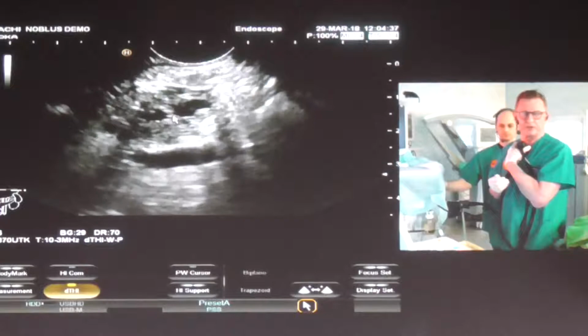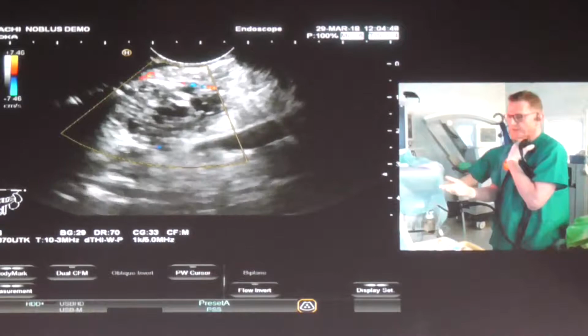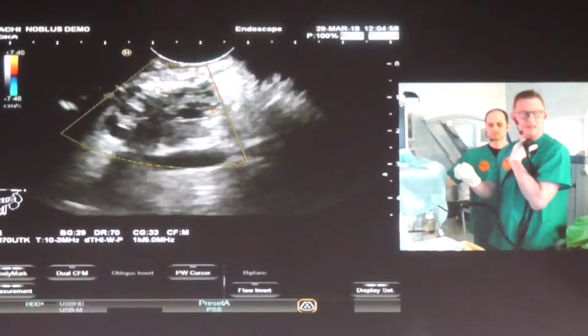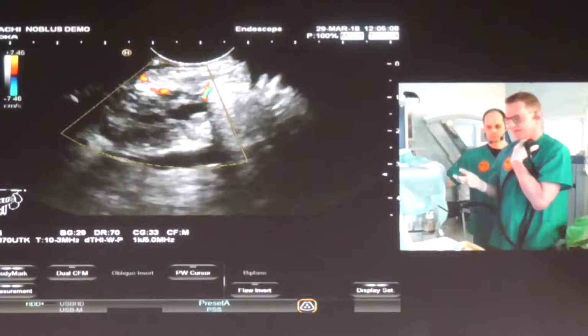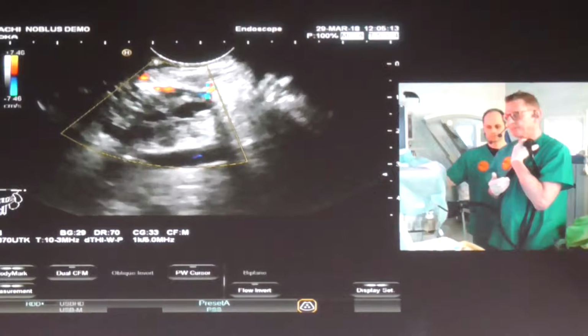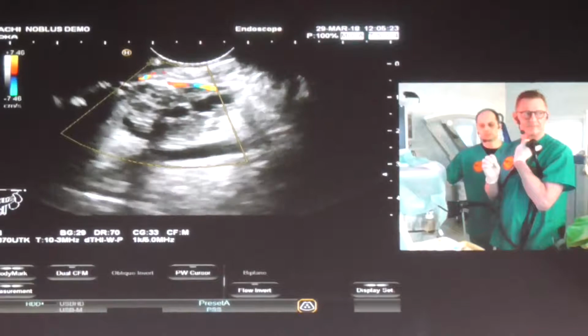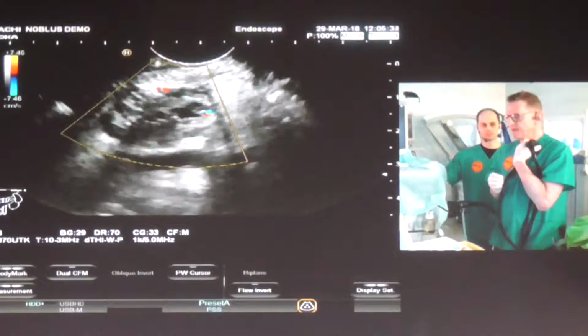If you look at this, I can do color Doppler imaging and confirm that there is no vessel flow inside at this point. I can do contrast-enhanced imaging, probably showing that septations have vessel signals. But it doesn't lead to anything else, but should we do surgery or should we not. We can do fine needle aspiration, and that helps, because in between 50 and 60% we can get a final diagnosis, meaning to show this is a serous cystadenoma or this is a mucinous cystadenoma. But that is cytology. We would like to have histology as well.